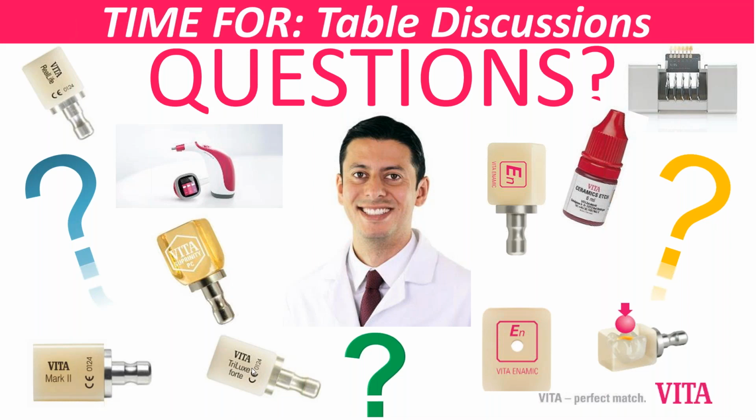And many times when this is designed that way, you can see slight mobility of the anterior teeth as well. So strong centric occlusal contacts on the posteriors, try to get 10 contact points between the bicuspids and the molars, slightly less contact in the anteriors, and a nice design that is not so steep, but we can have this anterior guidance with the night guard. And that's something that I would say works pretty well for us.